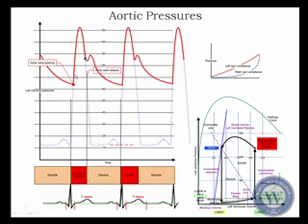Okay, you can actually tell by the acuteness and rise of the arterial wave here, to a certain degree, how well contractility is taking place. If it becomes more vertical, contractility is increasing, versus if it's sloping off, it means that contractility is getting worse. It also indicates to you how healthy the stroke volume is. The wider the stroke volume, the wider the arterial line will be.